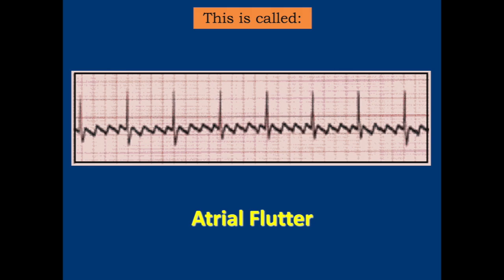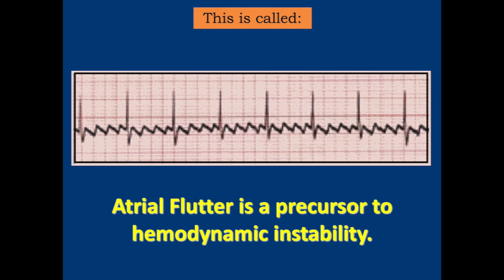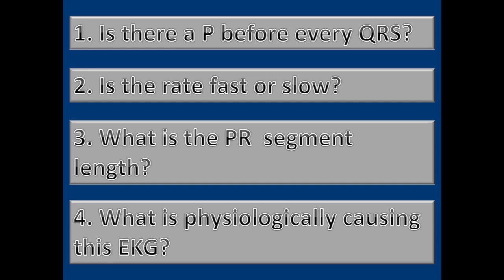Not seen too commonly, but I want you to see the waves. It's going to be different from atrial fibrillation. And it is a precursor to hemodynamic instability. So atrial flutter is not good for the patient. Here's your 4 questions again. Make sure you memorize them.